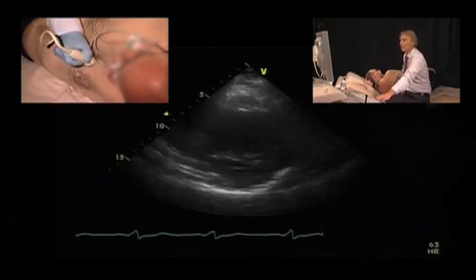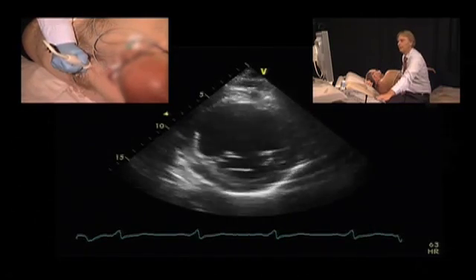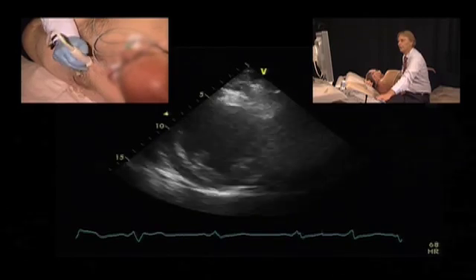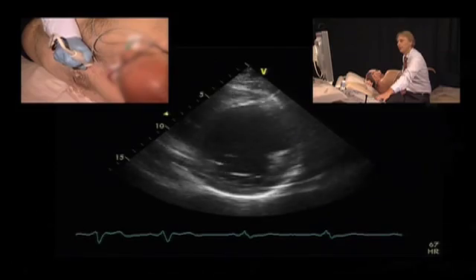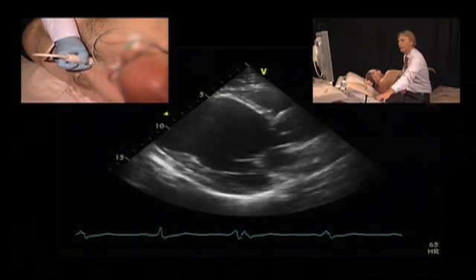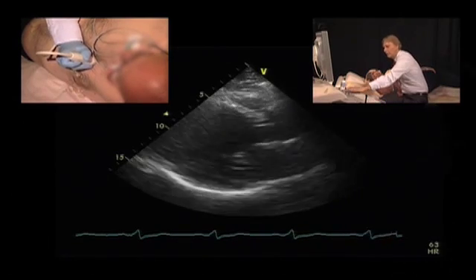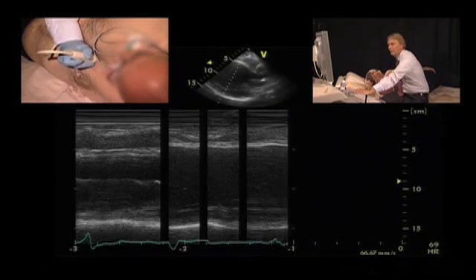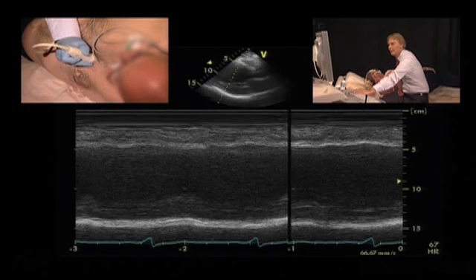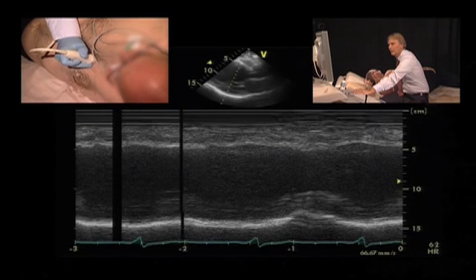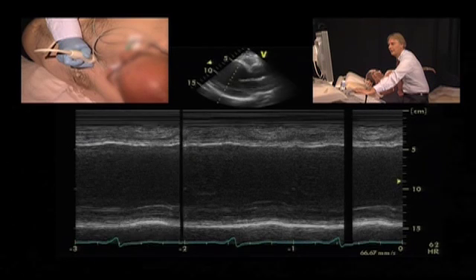We will perform a two-chamber view to take a look at the contractile function in all the different views. However, the problem is that from the transducer position, we are probably not optimal to really record an M-mode. I would probably prefer to perform the M-mode here, since I can move the transducer or move the M-mode imaging plane towards the apex. Even so, I will have to be very cautious to use this M-mode to really get a good feel for the size of the left ventricle.